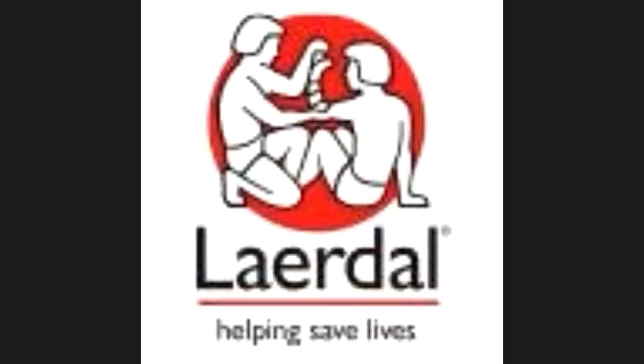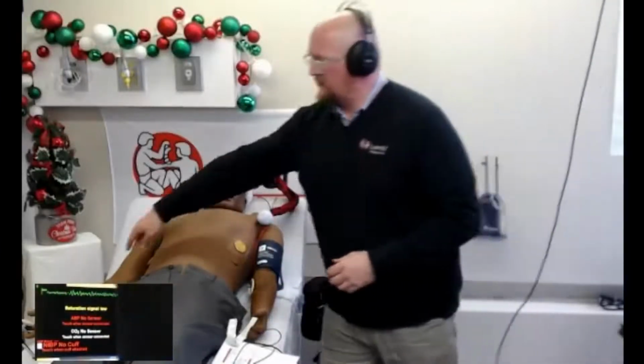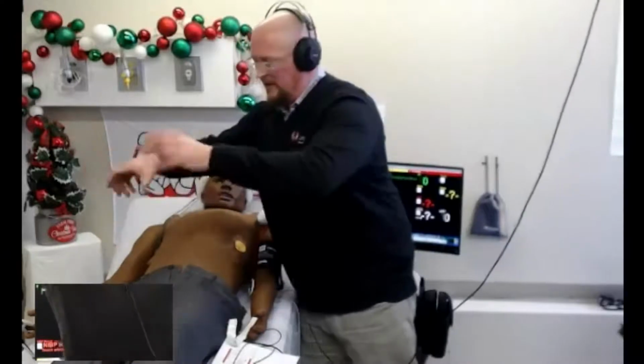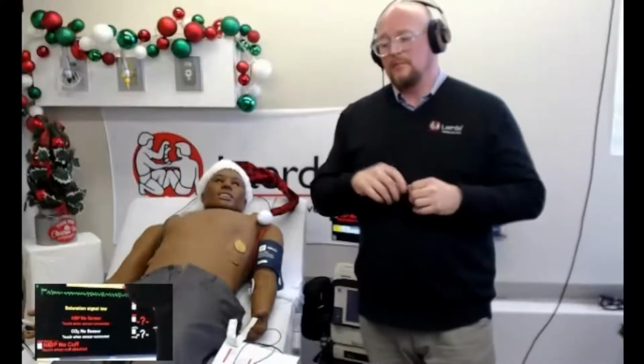That's great. Another one I used to like to do a lot is stabilizing the arm, and every time I touch the radial pulse, I have them scream, especially if they had a fracture over here and they were manipulating the arm. I just hit the pulse and he'd scream. So those buttons can be used for a lot of different things, not only the buttons on the computer, but also the buttons out here.